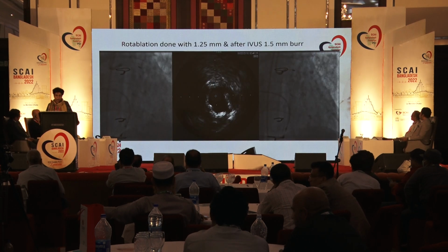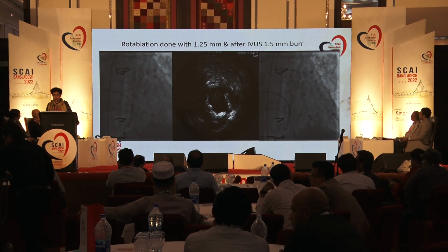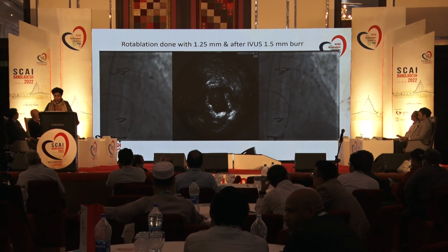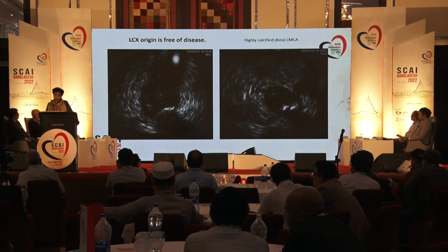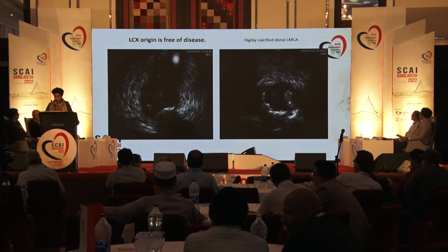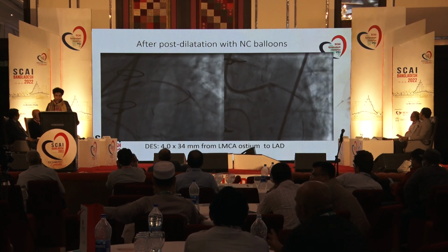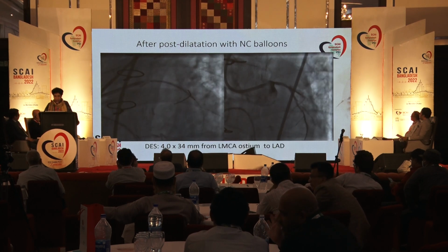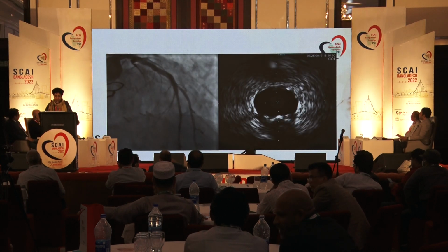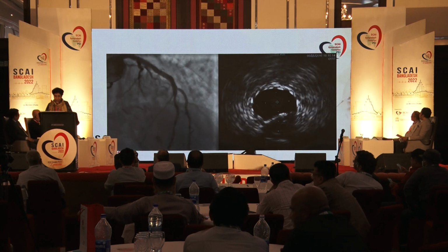At this point of time, we were able to take our IVUS catheter, and we saw that the calcium was indeed 270 degrees, and so we stepped up our burr from 1.25 to a 1.5 burr. The imaging also told us that the LCX ostium was free of any significant disease, which was great news for us. So we opted for a provisional stenting, took a drug-eluting stent 4 by 34 millimeters from the left main ostium to LAD, deployed it, did post-dilatation, and IVUS showed that the LCX looked fine, and so did the angiogram.